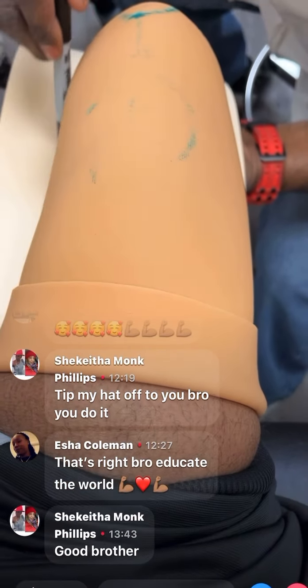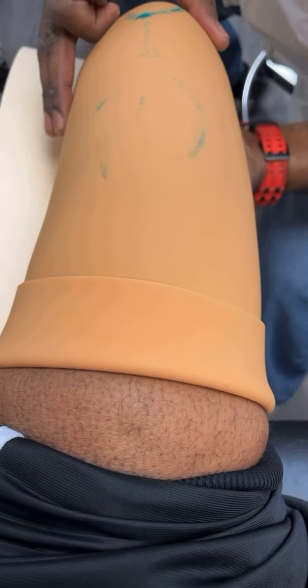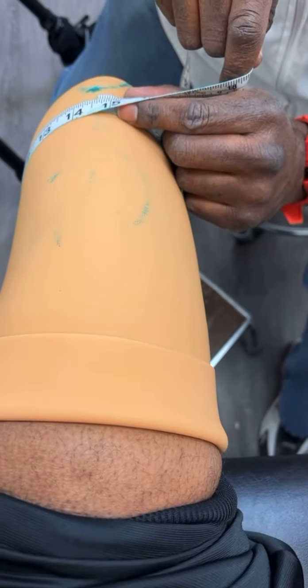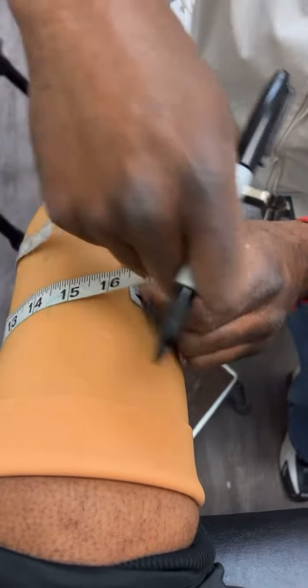As far as the socket, as far as measuring me — it's like the last part, then it's all in his hands. And based on the love you have for the position when dealing with people like myself and others, you have to be like this brother. It's not just his paycheck — I want to make sure you got a better quality of life. You can move better, you can stand better, you can walk better, you feel better.